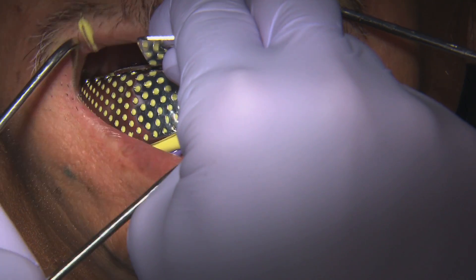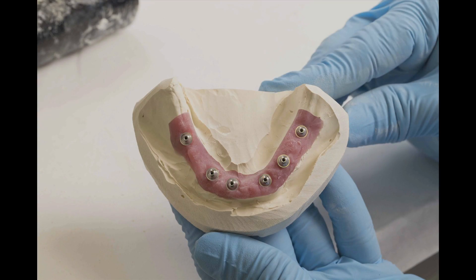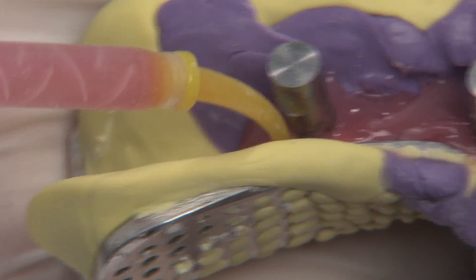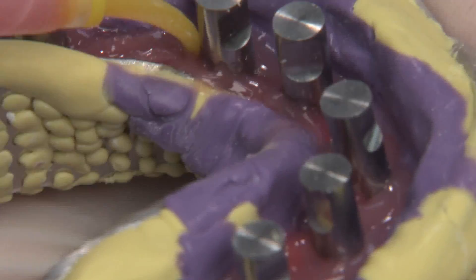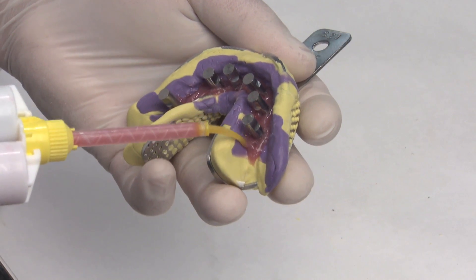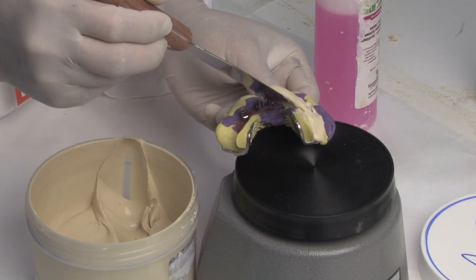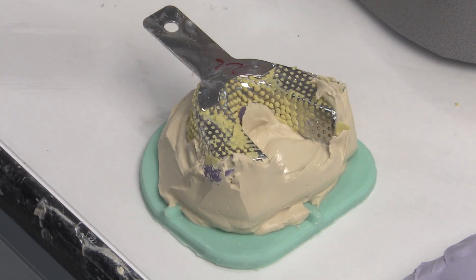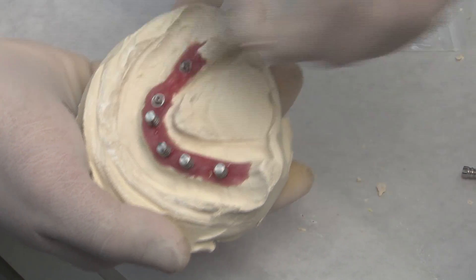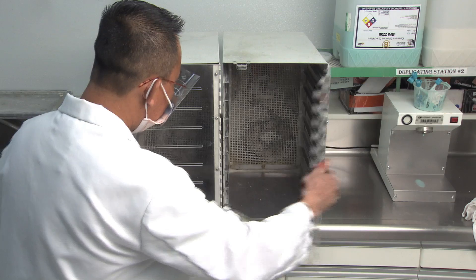After the doctor takes and submits the preliminary impression to the lab, the case is evaluated and the working model is fabricated. Implant analogs are attached to the impression copings and silicone-based soft tissue material is injected into the impression tray and allowed to dry for five minutes. This provides precise reproduction of the gingival contours around the margins of the copings. Ivory stone is then poured into the tray, allowed to set, and trimmed. The impression copings are detached from the analogs, and the preliminary working model with soft tissue in place is complete.